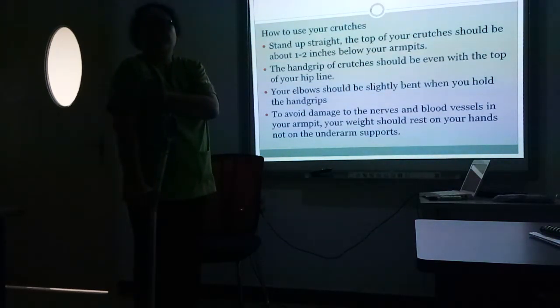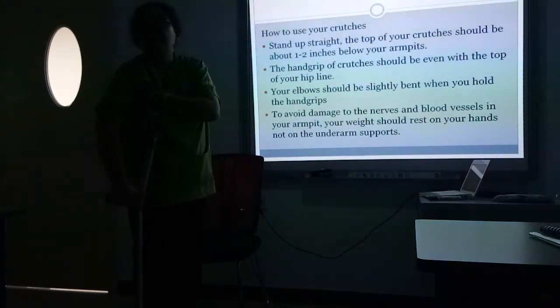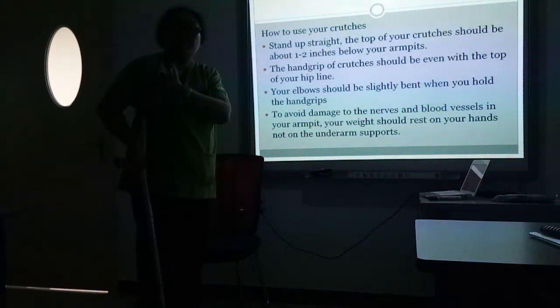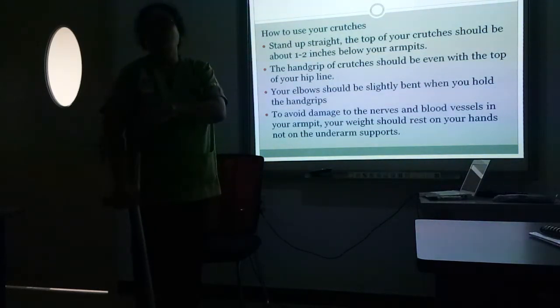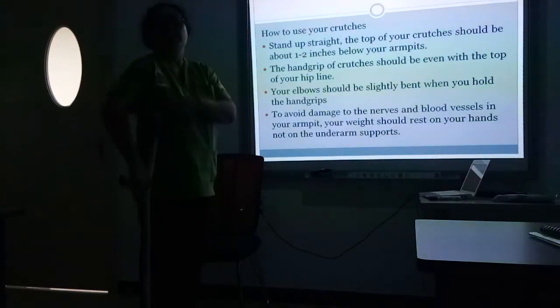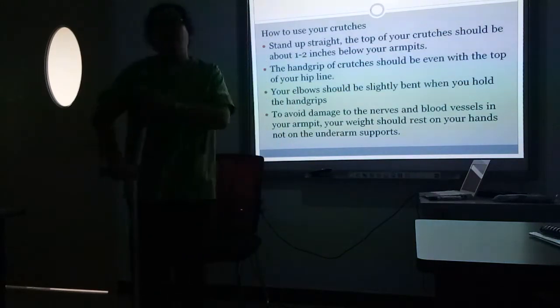Okay? To allow ang free-flowing blood circulation. Kasi pag sobra siyang ganyan, naiipit, ano pang blood circulation pupunta dito? Okay. Number 2, para maging relax yung shoulder. Pag-walk. Tingnan mo, pag ito'y sagad, ano mag-walk ka? Ganon. Diba? Okay.